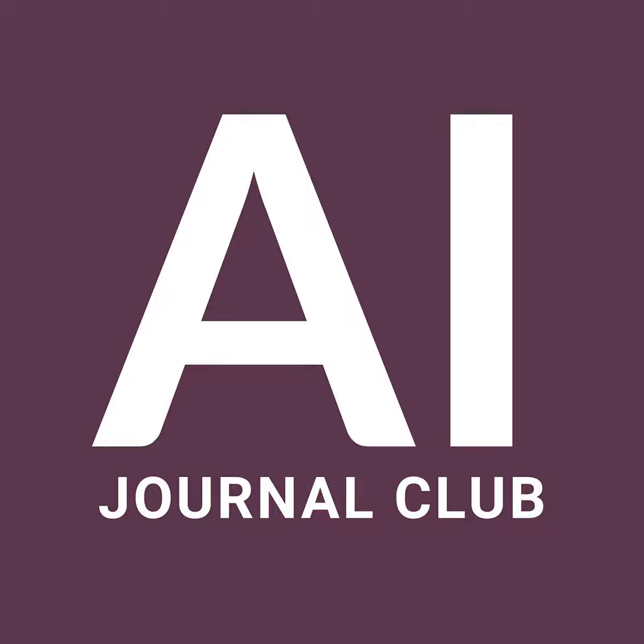What about things like brightness and contrast? So brightness needs to be at least 300 candelas per square meter. But contrast is even more critical. They want a ratio of at least 1,000 to 1. Why is contrast so important? Because pathology is all about subtlety. You're looking for a slightly darker nucleus, a faint wisp of something. If your blacks are just dark gray, those subtle features literally disappear. You can't see the disease.